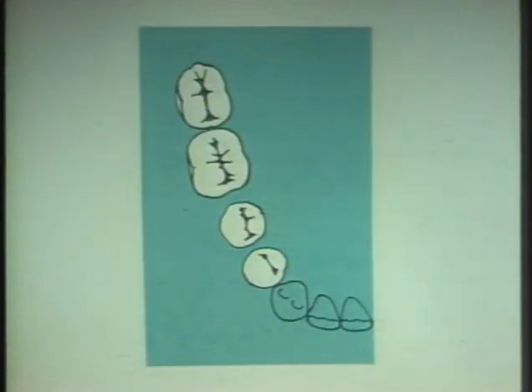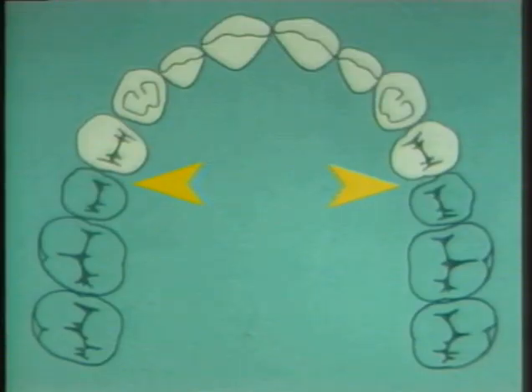The contact between the central incisors will often be chosen. Where it is reasonable to do so, spaced teeth should be avoided as anterior anchor contacts. When operating upon anterior teeth only, the contacts between the premolars on both sides will usually serve as suitable anchor teeth, clamps not being required at all.